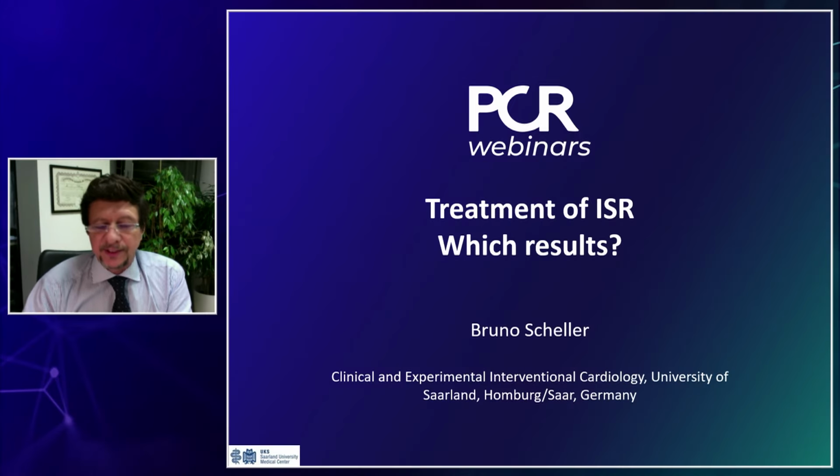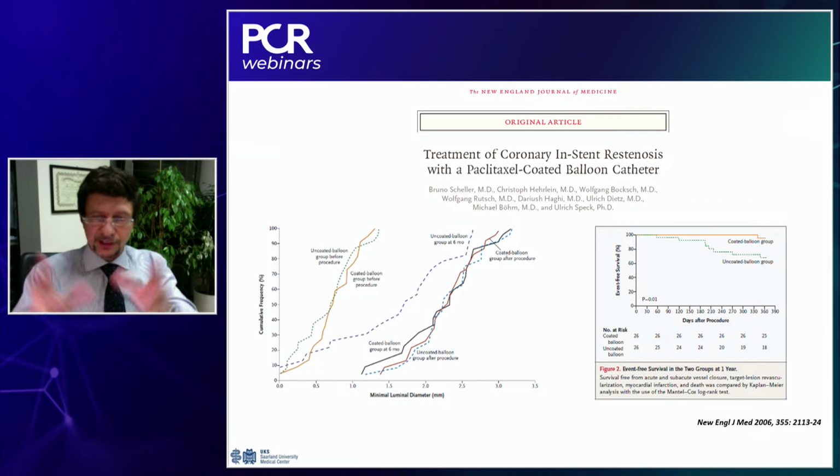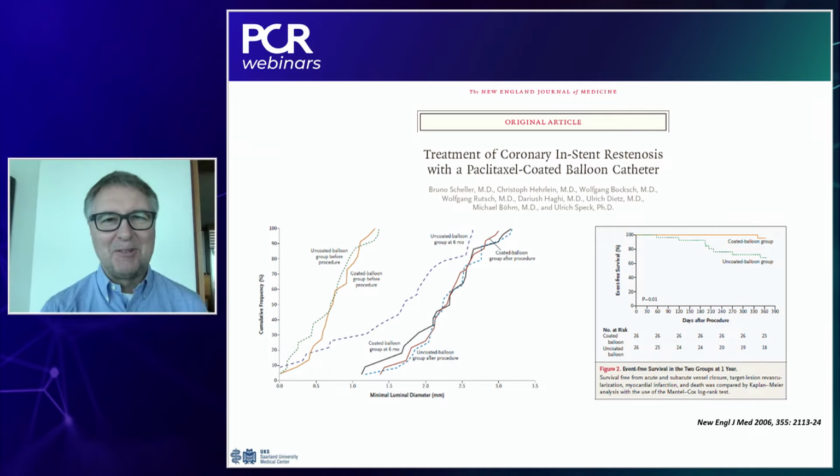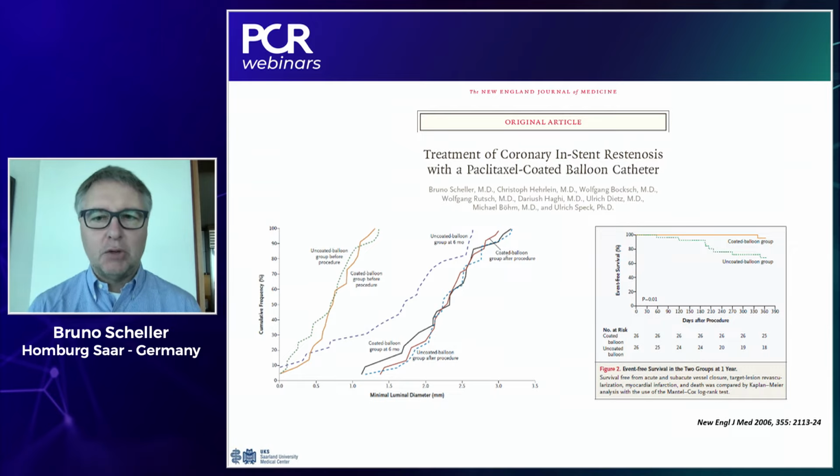Please, Bruno, update us on a little part of the history, how it came to your idea. You are a pioneer in that, on using drugs, and what is new in the scientific field. Okay, thank you, Flavio. A little bit back in history, when we had the first animal data with drug-coated balloon, we discussed how to conduct the first in-man trial. And at this time, this was in the year 2002, 2003, drug-eluting stents were not yet available for clinical practice.